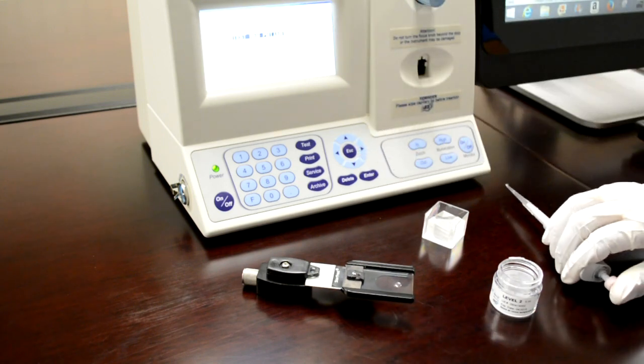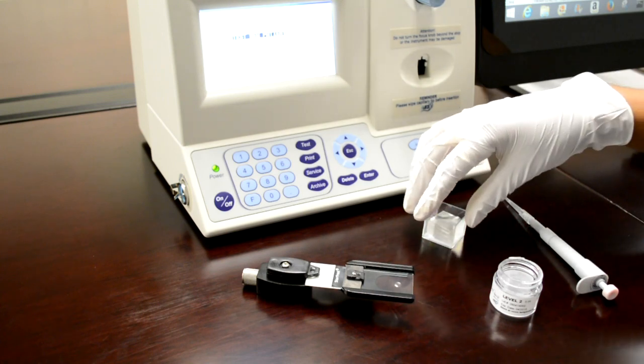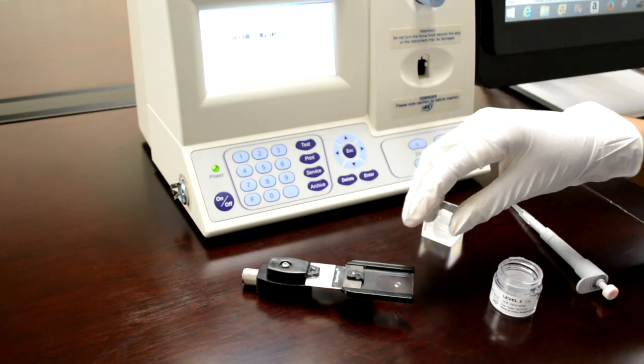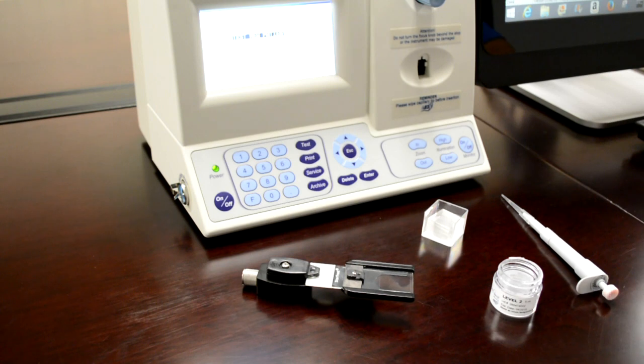Now, place a 22 by 22 millimeter cover slip over the drop. Allow to sit for about one minute to let the sample stabilize.